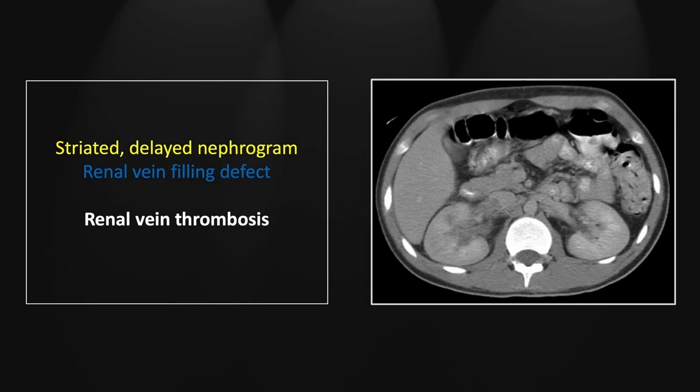This is a patient that presented with a fever, right flank pain, and dehydration. Note the heterogeneity of the right nephrogram and the slight delay relative to the left kidney.